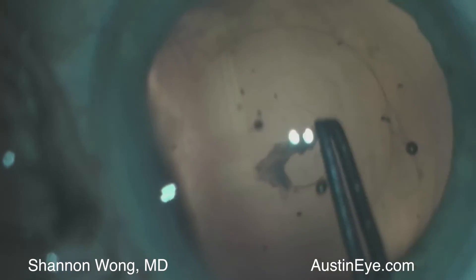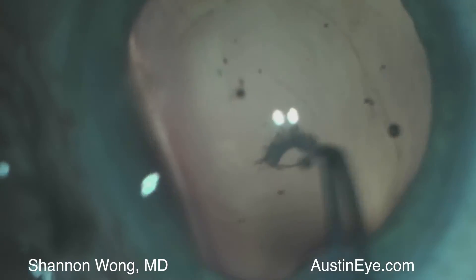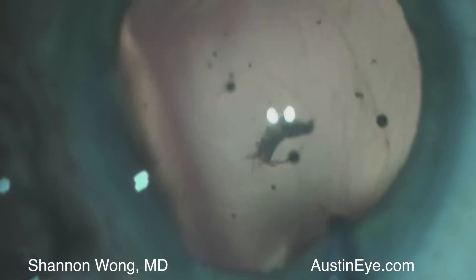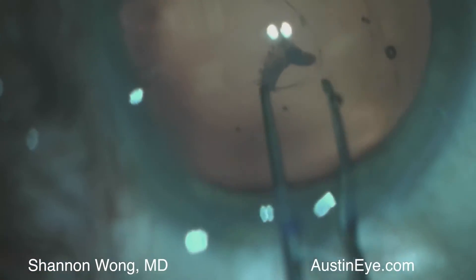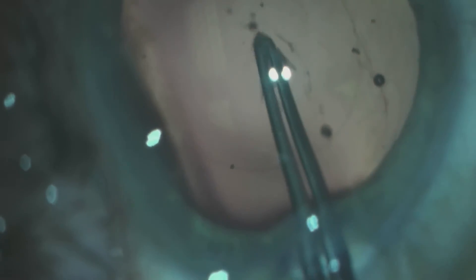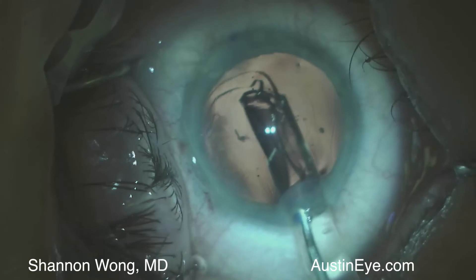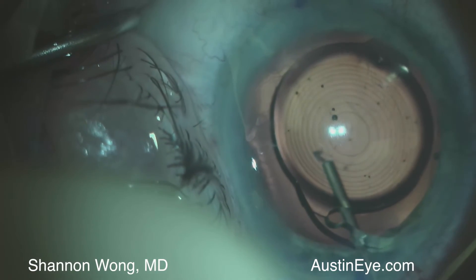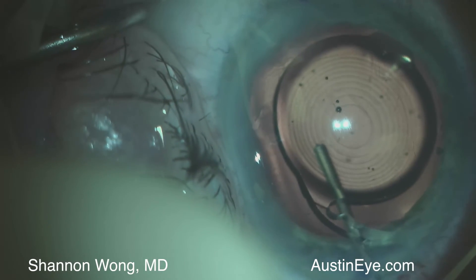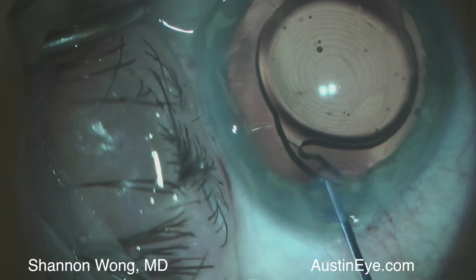We're able to successfully remove the plaque and preserve a circular posterior continuous curvilinear capsulorexis. We then insert a symphony lens implant into the bag. We use a cannula to remove small remnants of the plaque that remained behind the implant.